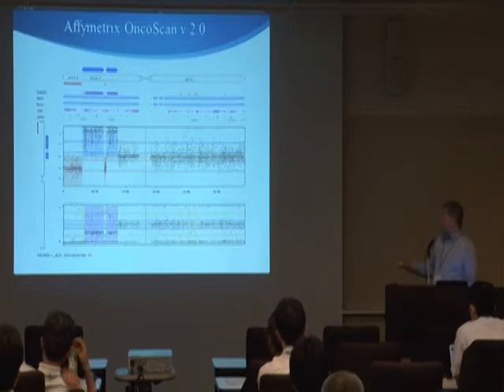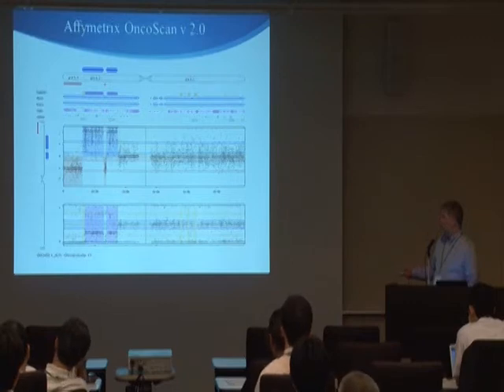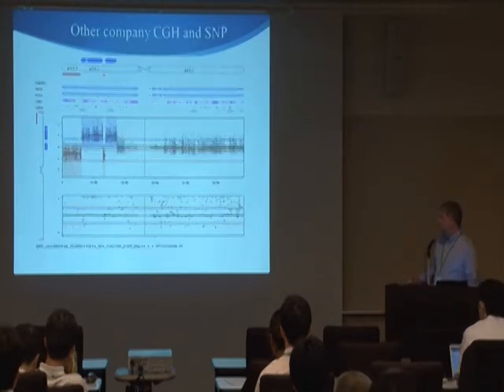And of course, it's very nice to see, using the OncoScan platform, that the copy number data and the allele profiles give you a confirmation of what you're looking at. So when you have losses, you can see that you don't have 3 allele tracks here. You don't have the 3 possibilities that you would in a diploid situation. And of course, when you gain copy number, you also have more tracks than you would in a standard diploid situation. So this gives nice confirmation about this information.